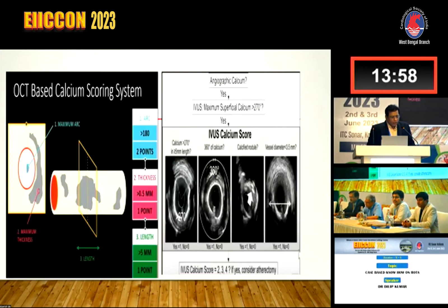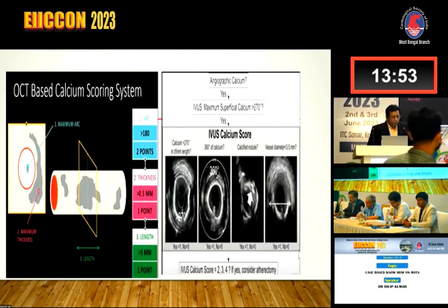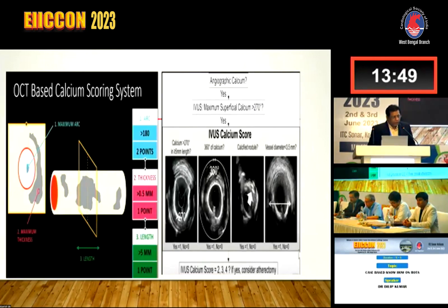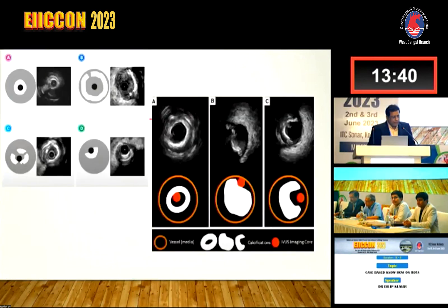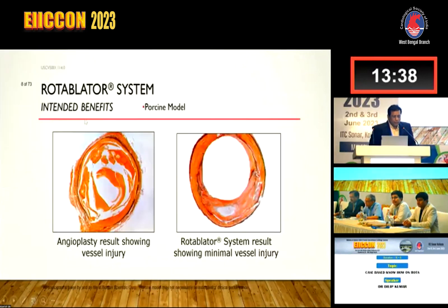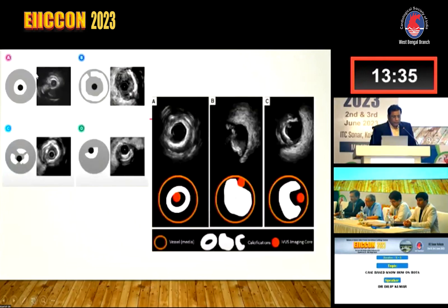Let's go around the algorithm of calcium - how we detect it. We have scoring algorithms now, OCT-based and IVUS-based. What we see is the arc of the calcium, the length of the calcium, the thickness of the calcium, and the vessel size which we see in IVUS. We get a calcium score and decide our strategies.